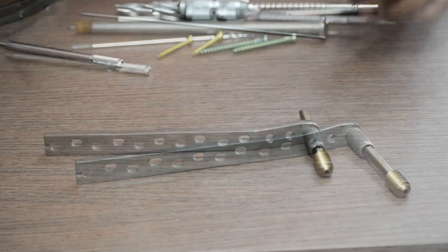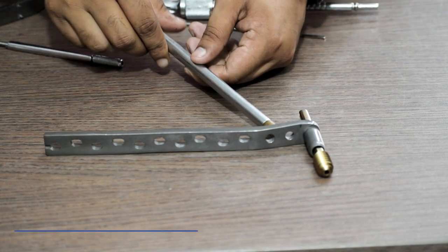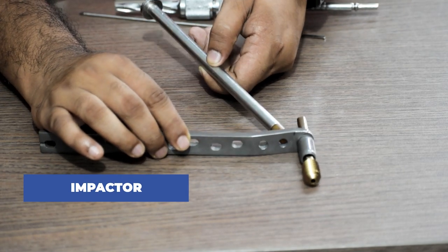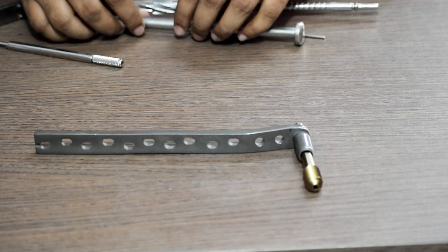Once completely locked, we check if the plate is not aligned. We will use the impactor and hammer it gently until it is properly placed on the bone.